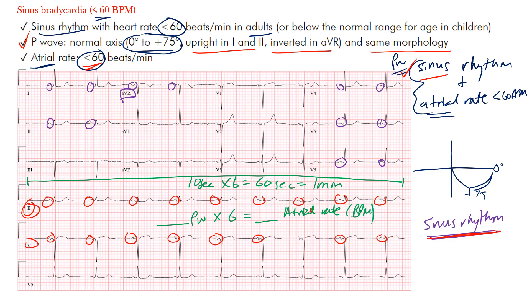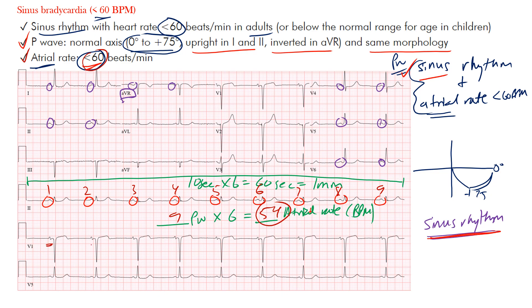Counting those circled P-waves: one, two, three, four, five, six, seven, eight, nine. Nine times six is 54 beats per minute — less than 60, so that criteria is met. Another method: count the thick lines between consecutive P-waves. Between two P-waves there are between five and six thick lines. 300 divided by five is 60, 300 divided by six is 50, so the rate is between 50 and 60 — confirming approximately 54 beats per minute.